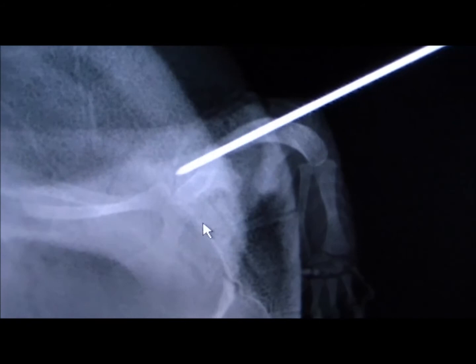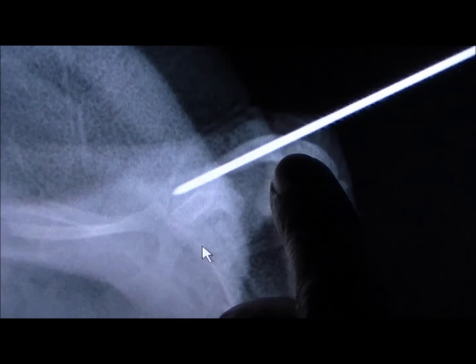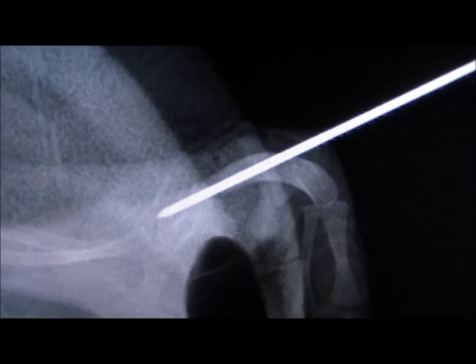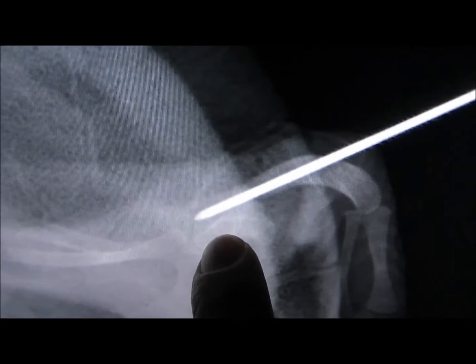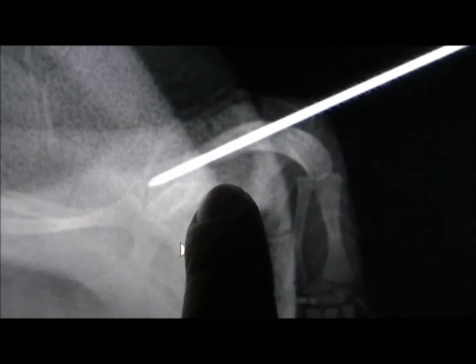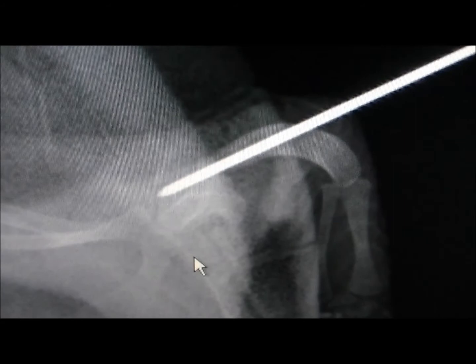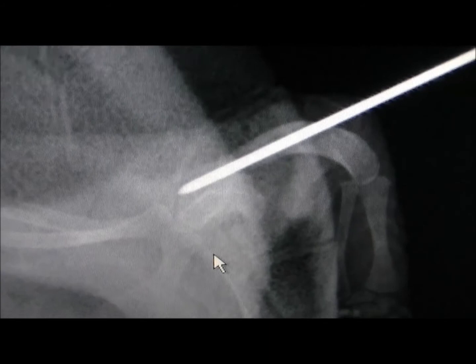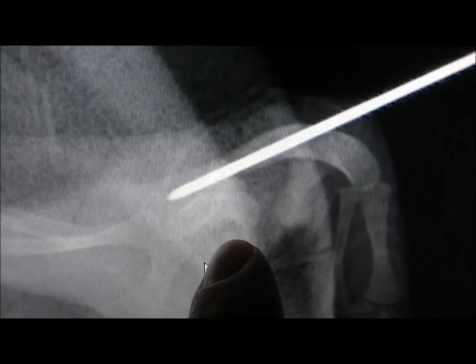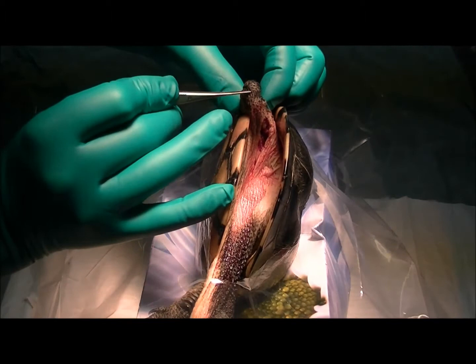I'm probably not a hundred percent happy with exactly how it's positioned, but I think that's as good as we're going to get in an animal this size. Here's the intraoperative X-ray with the pin in position. The pin is sitting in the humerus, coming out the side — because of the curvature of this bone, ideally we'd go up the middle, but it's just impossible with that curved bone. The good thing is it's away from her elbow joint. The pin is sitting just in that proximal fragment and hasn't gone into her shoulder joint, so she's still going to end up with a functional leg.